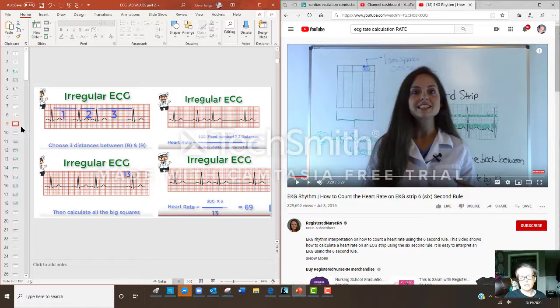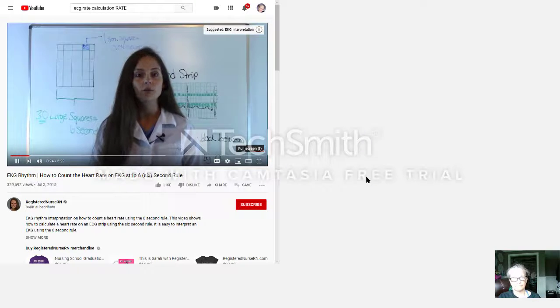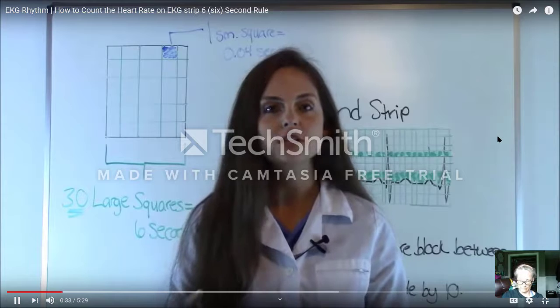So let's watch another video, and she's going to talk about the way to calculate heart rate with the 6-second rule. Check those out. In this video, I'm going to give you a quick tutorial on how to use the 6-second rule in counting a heart rate on an EKG. There's various techniques you can use, but I find that the 6-second rule is the easiest, especially if your rhythm is irregular.